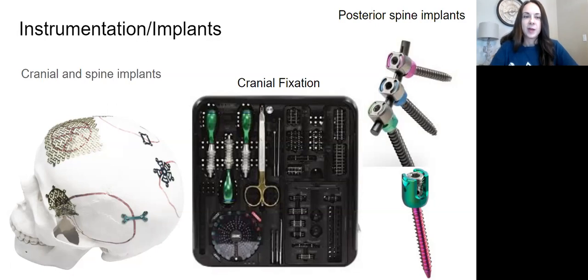So there are big mesh pieces for if there's a hole that we don't plan on filling in with an implant, maybe that's how they want to fix that. They have big mesh pieces for that. They have scissors so that you can cut it. Lots of different options for you, but I will say anything plates and screws, we're going back to orthopedics. So even though we won't be measuring for these screws, it'll just be plate, screw, they should never have to wait on that. If they're plating, you should already know, load another screw, have it ready.